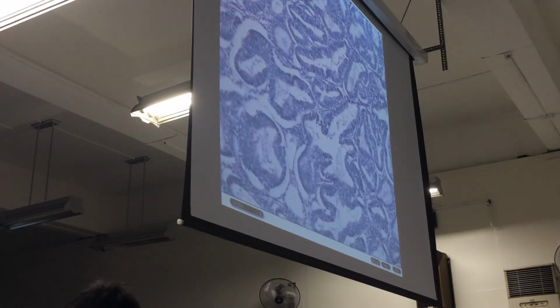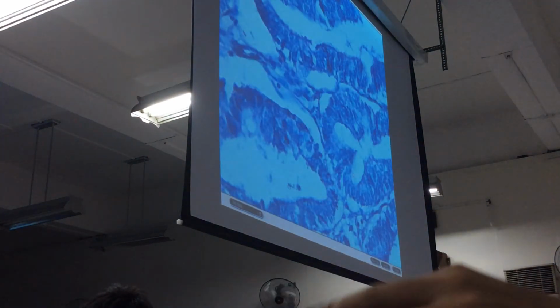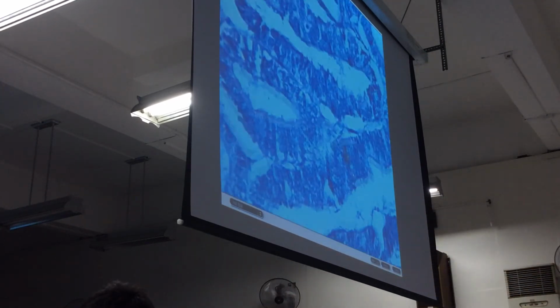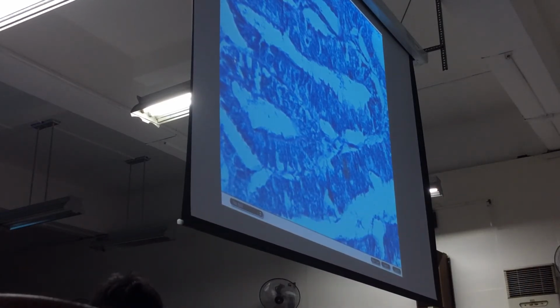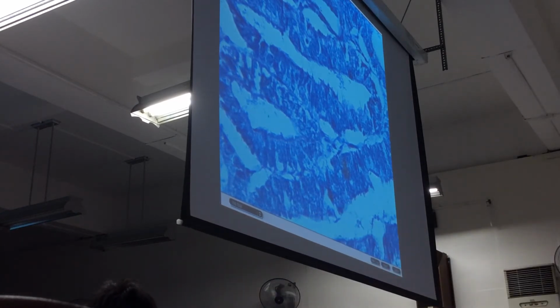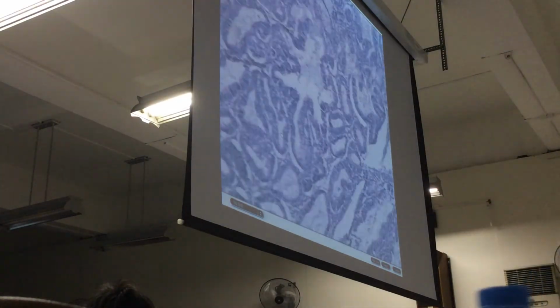That's complex hyperplasia. Now the big question is, does this have atypia or not? The same is true with what I've told you before. So you see here elongated nuclei, perpendicularly arranged against the basement membrane. So you don't have atypia in these glands. If you're shown this, that's complex hyperplasia without atypia. But look at the other areas in this particular slide. You will see hyperchromasia.